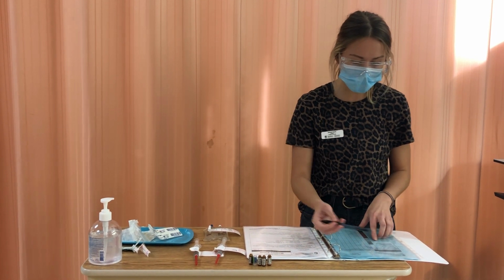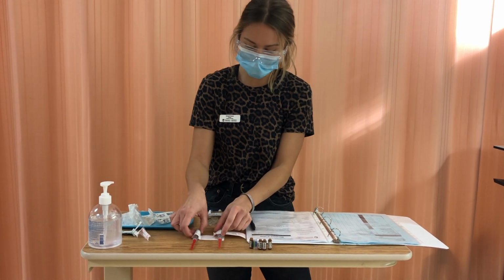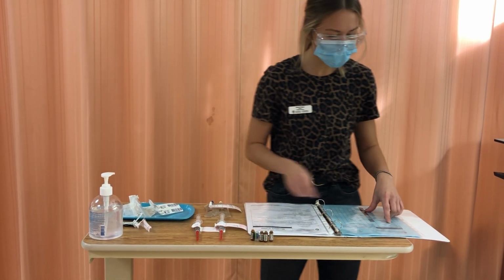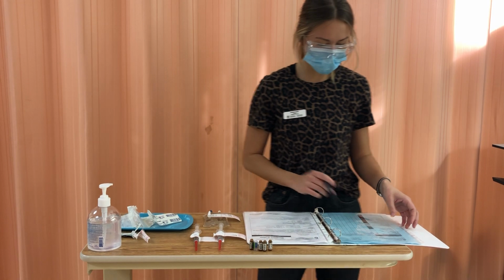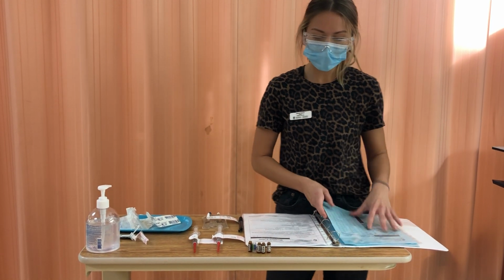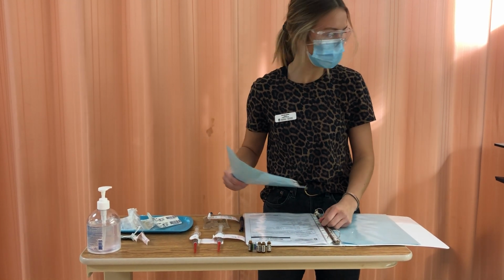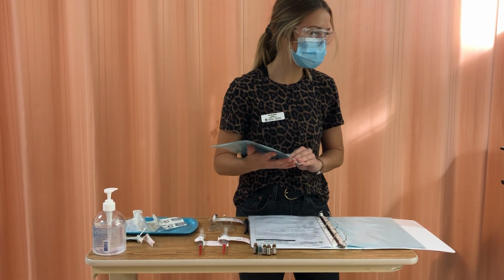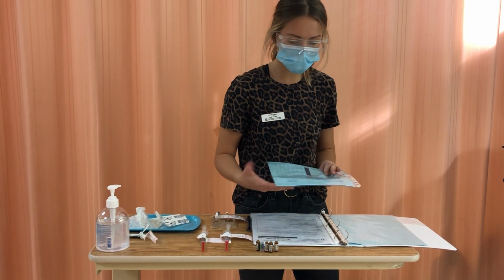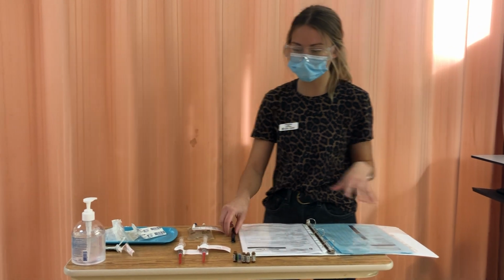The right route is PCA. I have a PCA MAR here. I reviewed that I can give it PCA according to my monograph, and these are all IV medications that I verified, and the right time to give it is now. And I'm looking here that there's a 5-minute lockout interval as well, and there's no continuous infusion ordered. So that is good. So now I will be putting my MAR, and I'll get my second nurse to now verify this, and she has verified that this is correct.